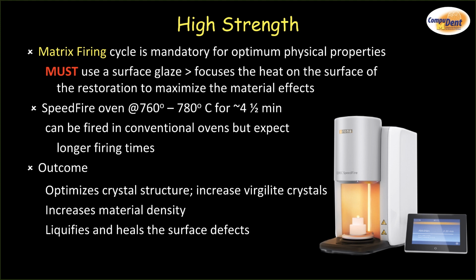And the outcome of this is it optimizes the crystal structure, increases the virgilite crystals, which enhances its strength, increases its material density, and it liquefies and heals any surface defects that may have occurred during milling. So this is a must. You must do the matrix firing.